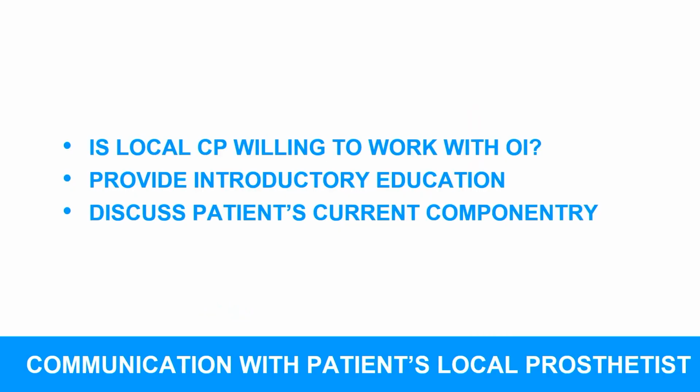When Dr. Stoneback gives the patient the green light for OI, I call the local prosthetist and I ask them, first of all, are you willing to see osseointegration? If they say yes, then I provide introductory education for them: what type of implant they're going to receive, what type of connector, the rehab process, and then we go over the patient's individual componentry. Number one, to make sure they're safe. If it's a C-Leg, make sure it gets serviced before they go for osseointegration. And then, is there sufficient room?